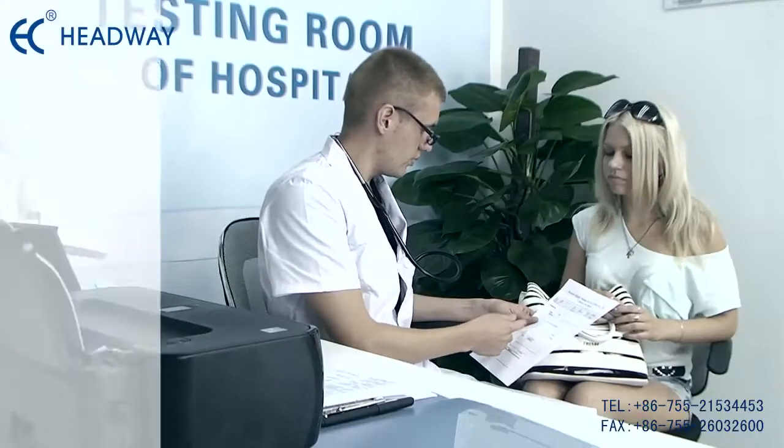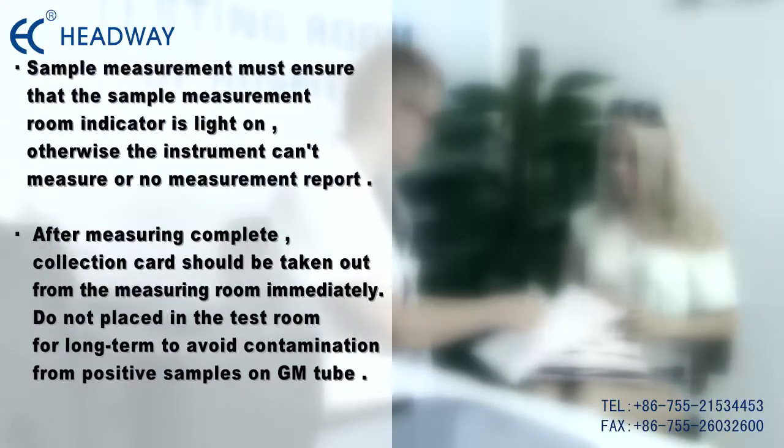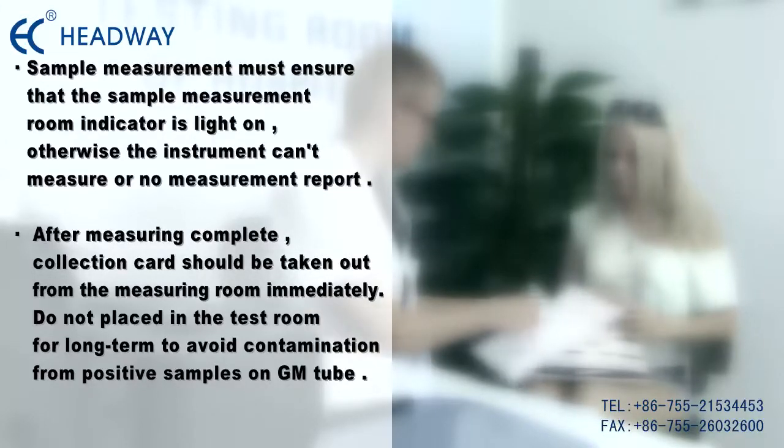Finally, the screen should display the result. Sample measurement must ensure that the sample measurement room indicator light is on; otherwise, the instrument cannot measure or produce a measurement report. After measuring is complete, the collection card should be taken out from the measuring room immediately.